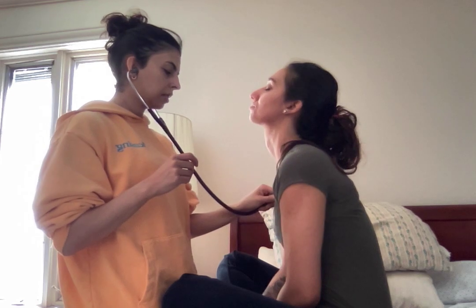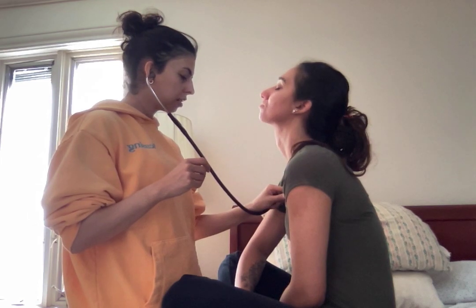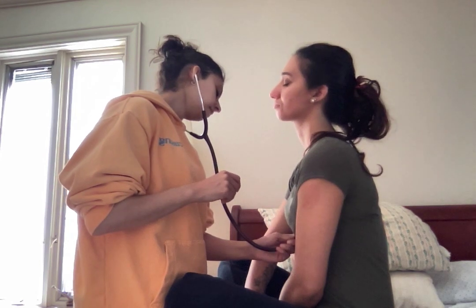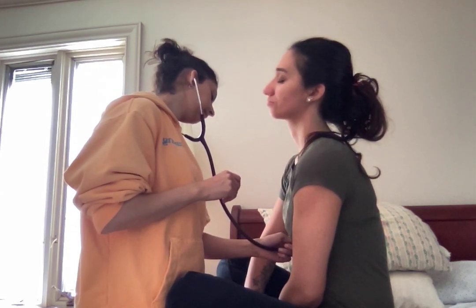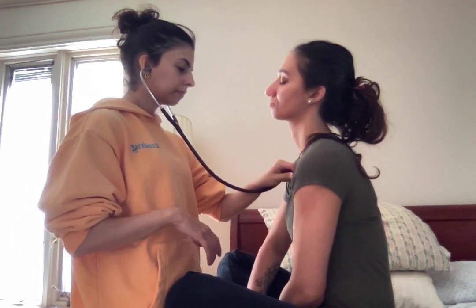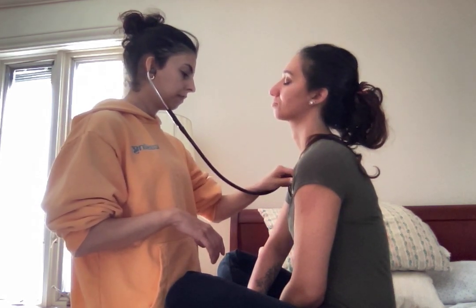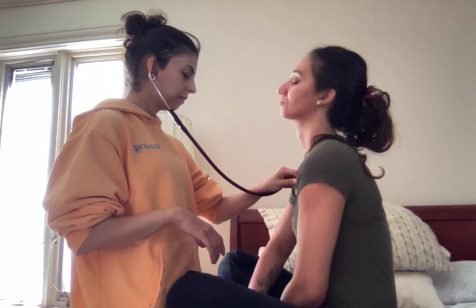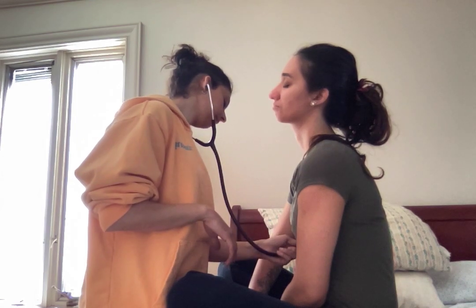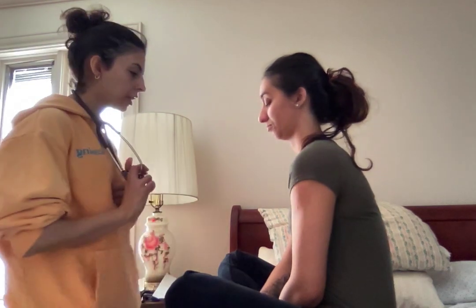So starting on the right side, your aortic. Left is the pulmonic. Tricuspid. Mitral. Repeating it again using the bell. S2 is heard. Tricuspid. And then the mitral. S1 and S2 are both heard.